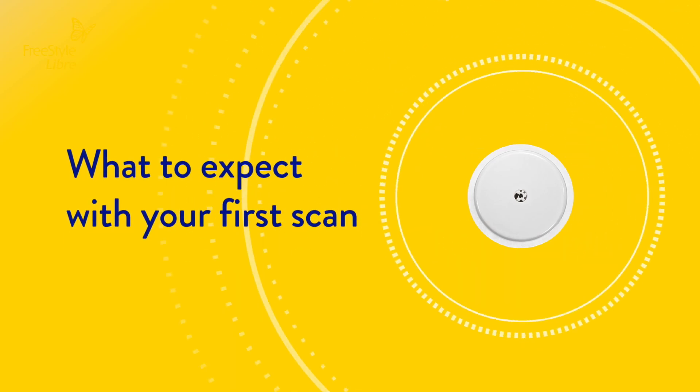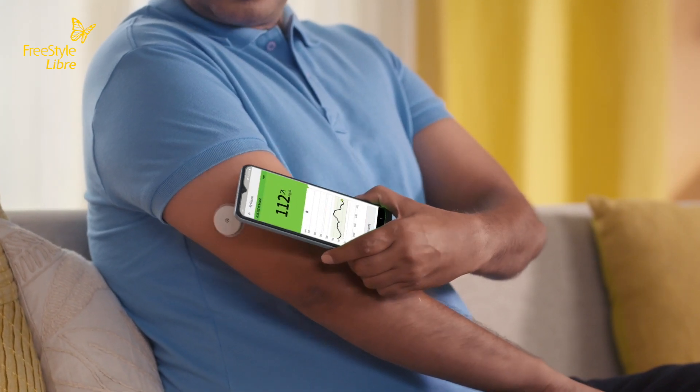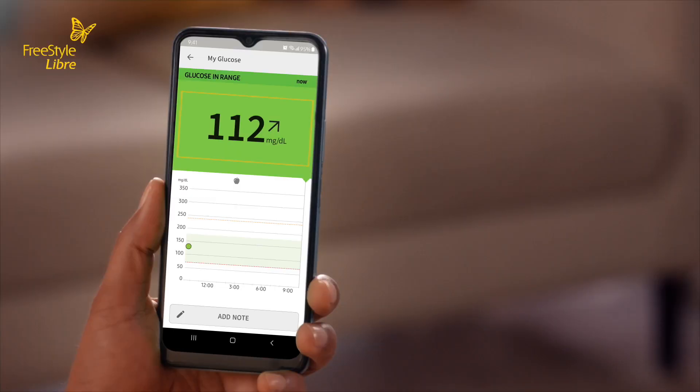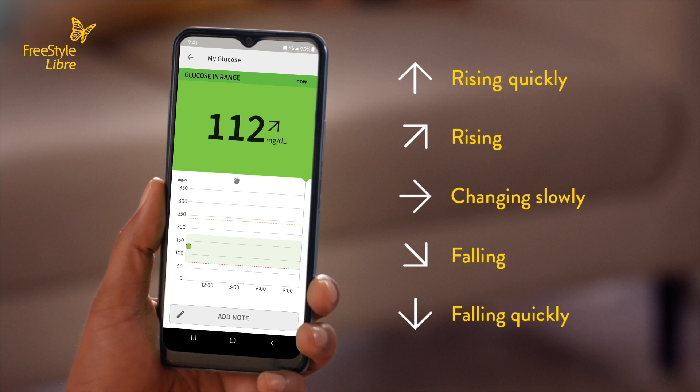Let's talk about what to expect with your first scan. Bring the phone to your sensor to scan it. On your first scan, you will see your current glucose reading and a trend arrow. Your trend arrow shows you what direction your glucose levels are heading in — changing slowly, rising, falling, falling quickly, and rising quickly — allowing you to act instead of react.